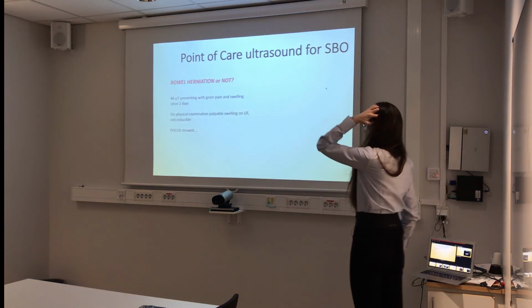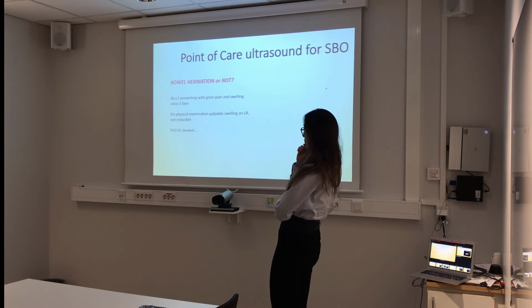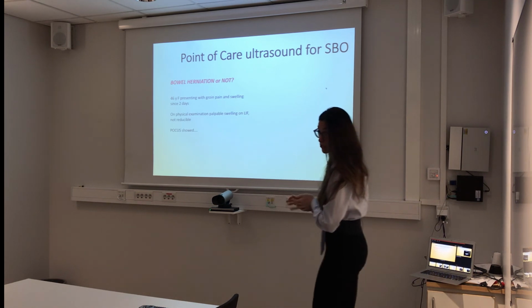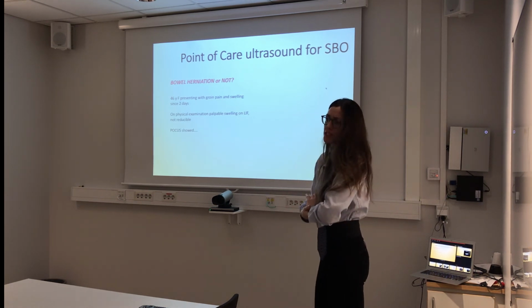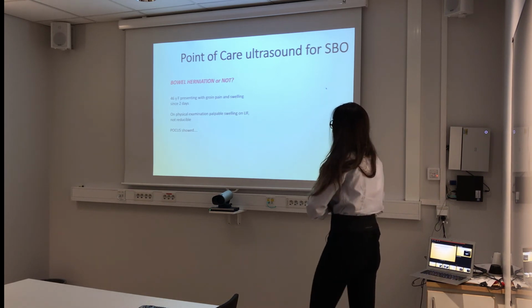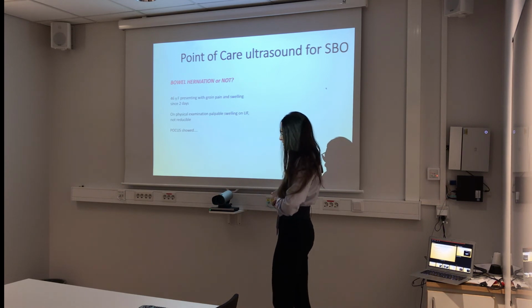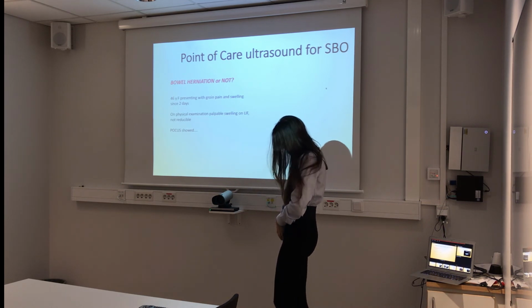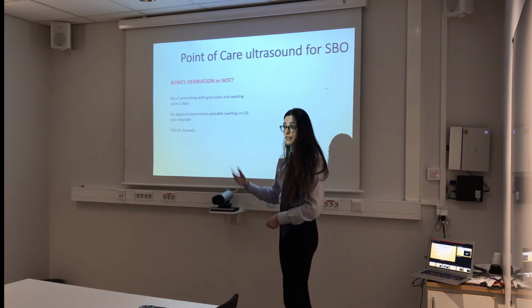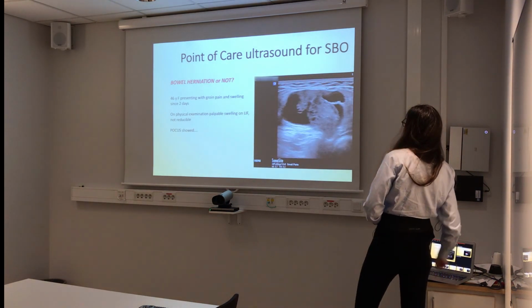This is, for example, one of two cases that I just throw in. My patient, 46 years old, presenting with groin pain and swelling since 2 days, was a lady. So we know that ladies are normally more predisposed to femoral hernia than inguinal hernia. On physical examination, palpable swelling. I was down with the surgical team, I was rounding, and he said, well, is the bowel in or not? It was actually quite popping out, a quite big hernia. And I said, okay, we're here, let's do the ultrasound. And this is what the ultrasound showed.